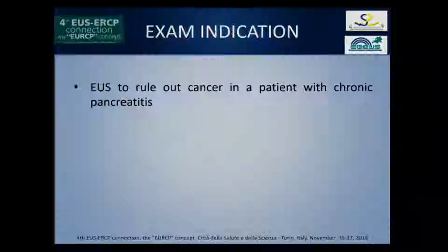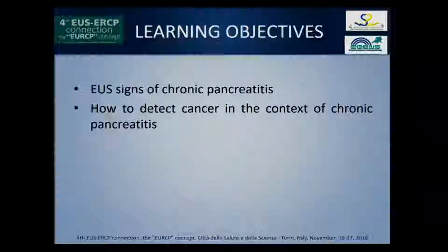So we're going to perform an EUS in order to rule out cancer in the context of a chronic pancreatitis. We're going to discuss EUS signs of chronic pancreatitis and how to detect cancer in this not simple context. We can pass to the procedure.